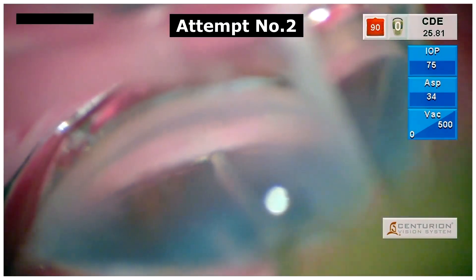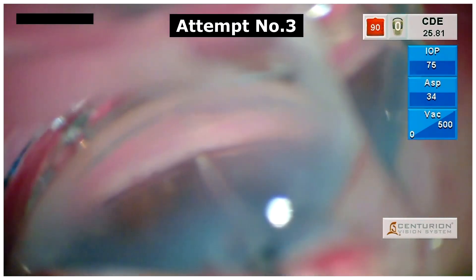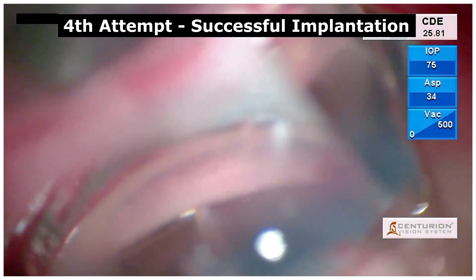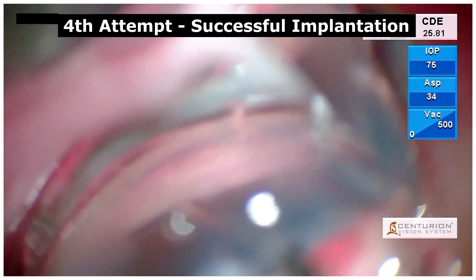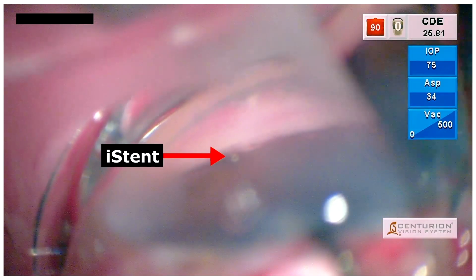With every reattempt, the trabecular meshwork gives away. So we had to change our maneuver into a more firm and forced glide into the trabecular meshwork for proper implantation and stable placement of the iStent.